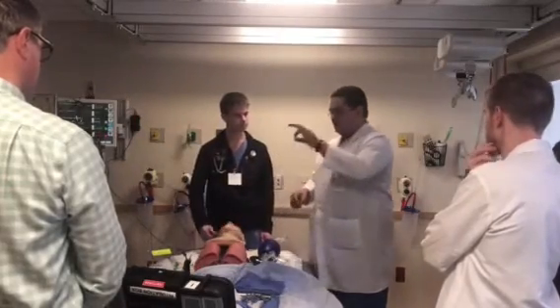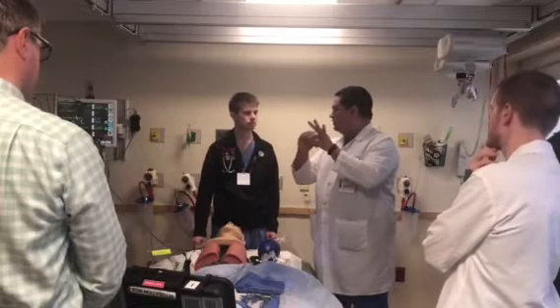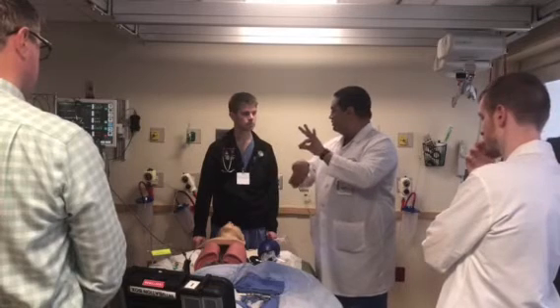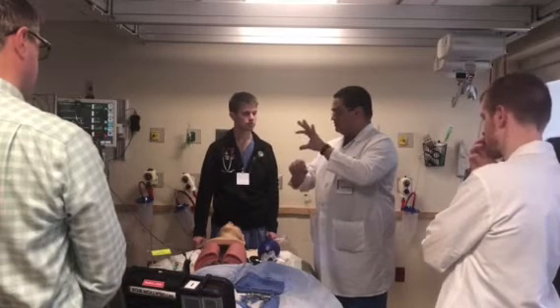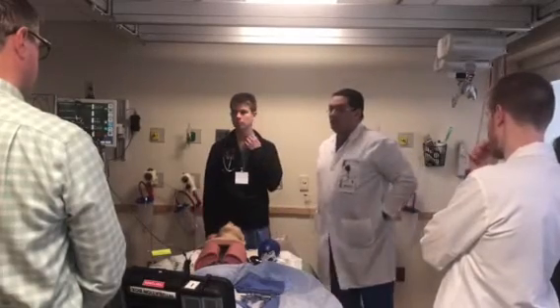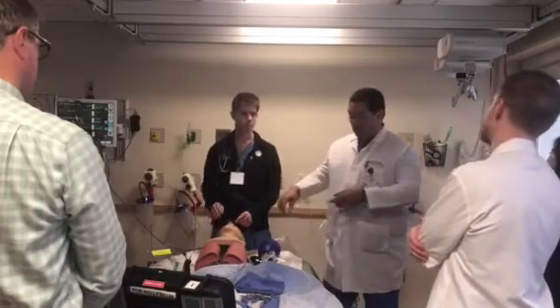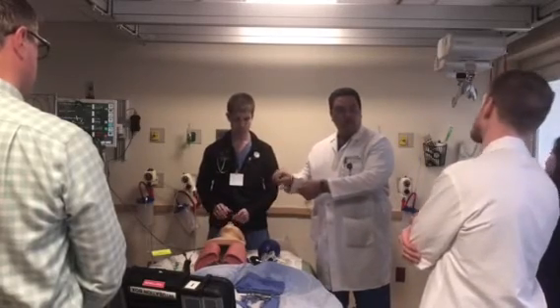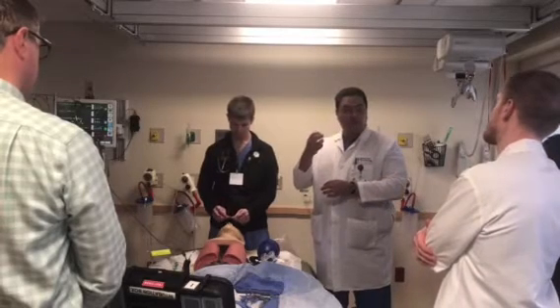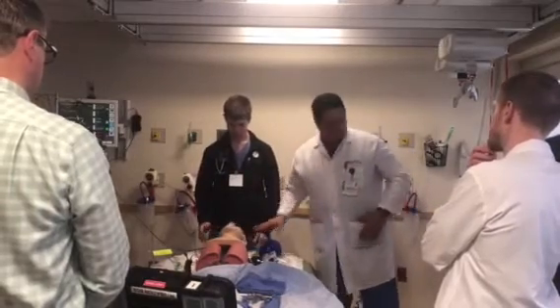Okay. And if you're stretching like this, the skin and the larynx are so close to each other, it's impossible to fit a whole crike in between. It's just going to go on the larynx. If you let go and this space opens up, then you may be able to. Some people like to put a bougie in this step. I don't like that, because the bougie can actually make a false passage, but the tube is big. It's not going to make a false passage. Okay. All right, so we're done with that step.